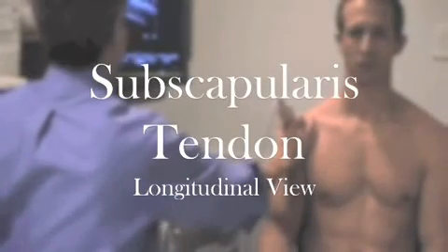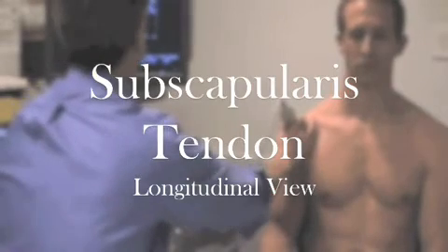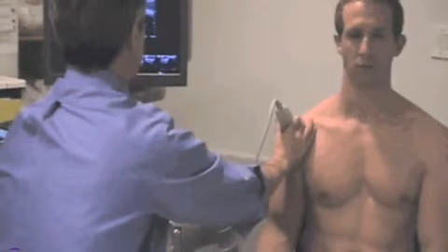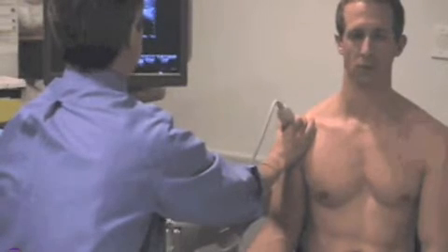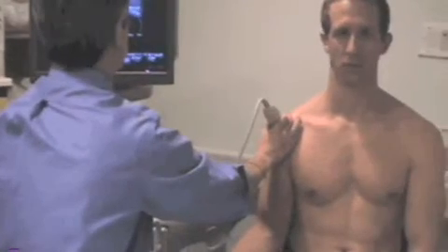This video will demonstrate imaging of the subscapularis tendon in the longitudinal plane. In order to image the subscapularis tendon, the probe is positioned at the level of the bicipital groove. The patient is seated with the elbow flexed and forearm supinated. In order to image the tendon, the arm is slightly externally rotated. This brings the tendon into view.